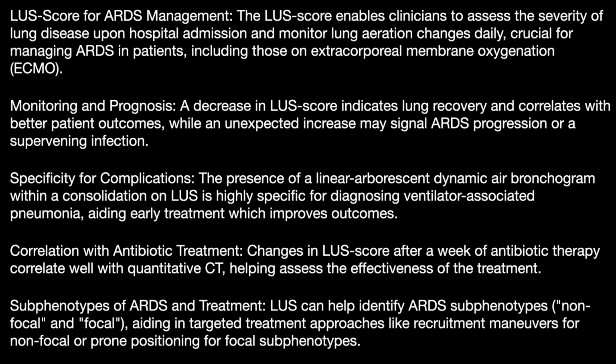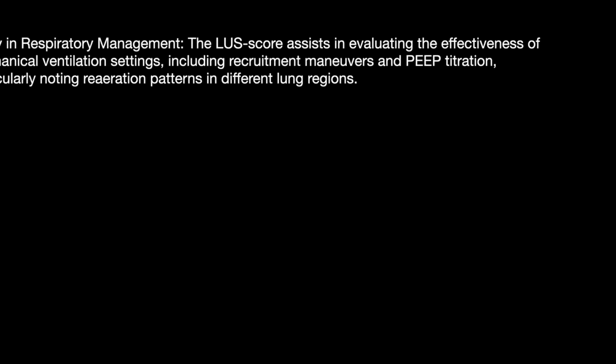Now, lung ultrasound score can help identify ARDS subphenotypes, that is non-focal and focal, helping in identifying focal and non-focal causes and in a targeted treatment approach, like recruitment maneuvers for non-focal, prone positioning for focal subphenotypes.